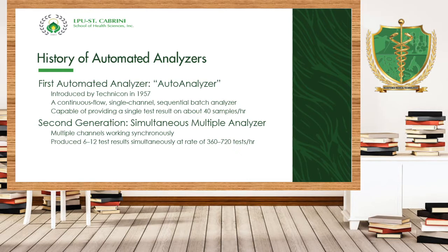Remember that automation allows the medical technologists to give focus on the manual technique. I will not go deeper on that because we have discussed that before. And before we proceed to our next discussion, I want you to take note that there are three analytical processes involved in the clinical laboratory, such as the pre-analytical, the analytical, and the post-analytical phase. Okay? So we have here the first automated analyzer, which was introduced by Technicon in the year 1957.